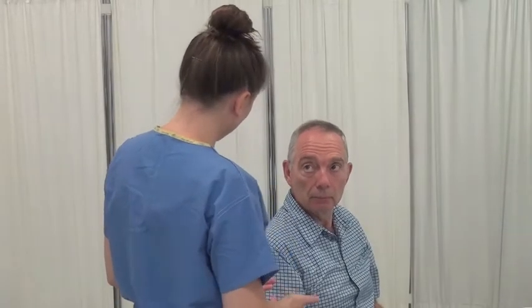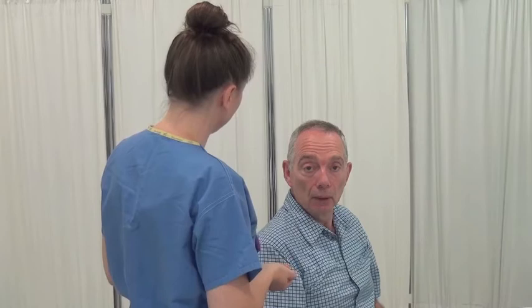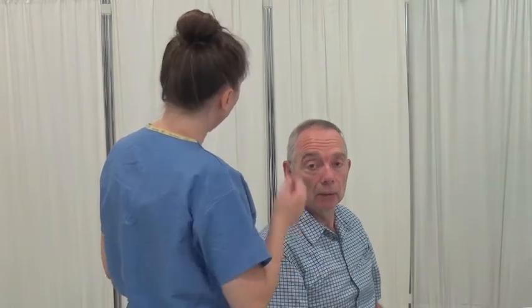I need to take your temperature now in your ear. Do you have a preference? This ear has been fine. Okay. I will need to just pinch the top of your ear to get the correct position. If it's uncomfortable, just let me know. Okay.